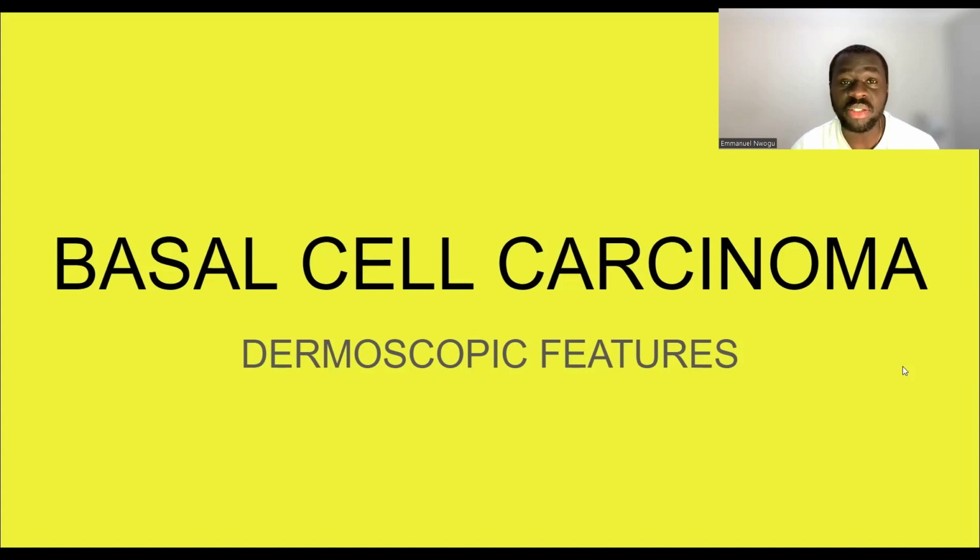One of the fairly common skin malignancies you will see around is basal cell carcinoma. A lot of basal cell carcinomas occur more on the head and neck areas, but sometimes they can be found on the trunk and limbs. Let's have a quick look at some of the things that would help you identify a basal cell carcinoma on a dermoscope.